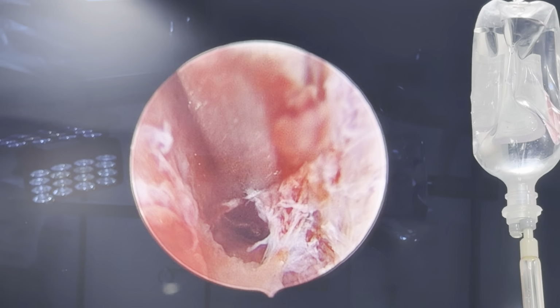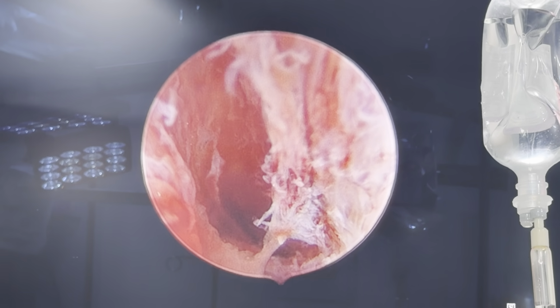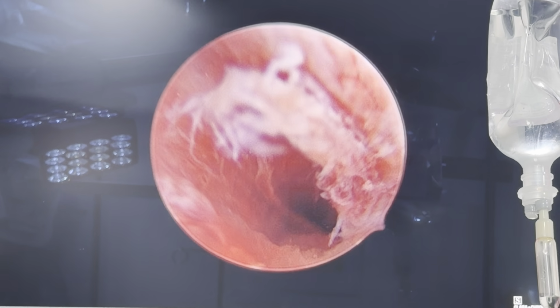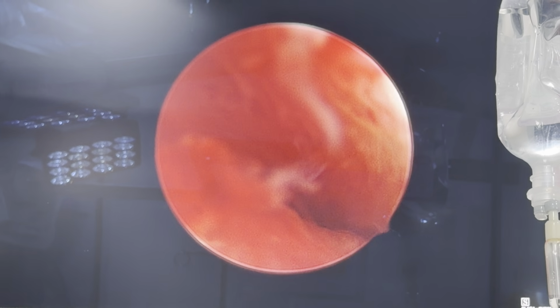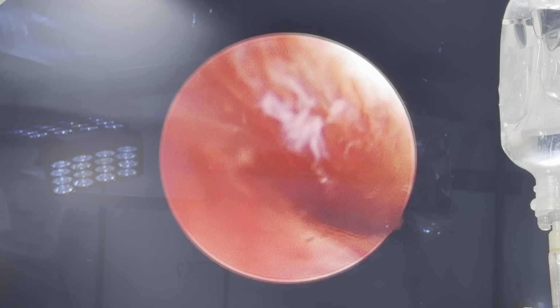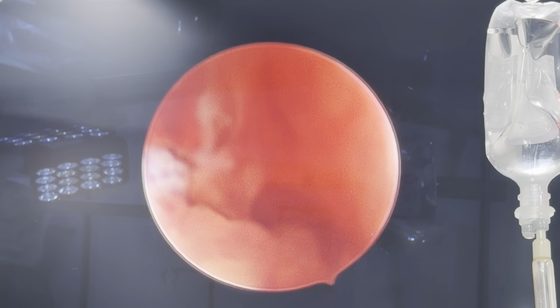So now I'm going to try to put my scope through this passage that I've formed. The scope was able to go in quite easily. I didn't face any resistance and I thought I'm inside the cavity. But as you can see, I can't really visualize anything. It was just blood. This was not very comfortable to look at.